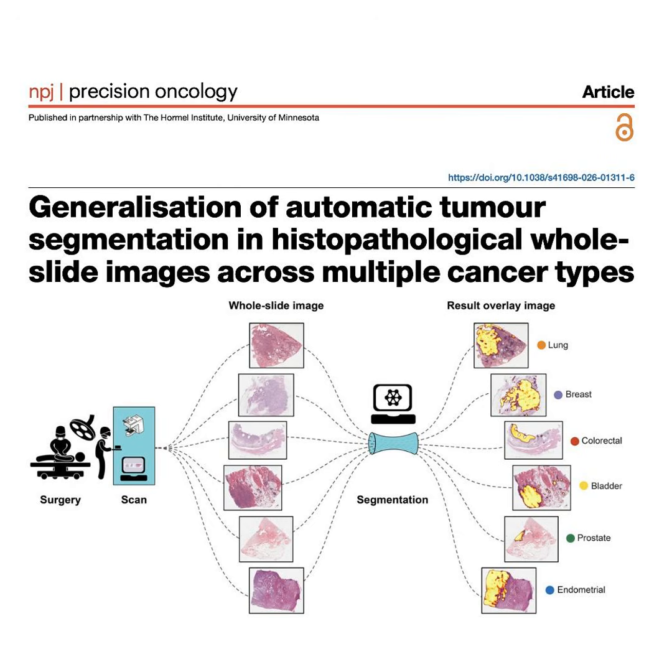Yeah, which brings up the classic machine learning trap: class imbalance. Right. If you feed an AI 10 times as much lung tissue as endometrial tissue, it's naturally going to optimize for the lung tissue just to get the highest overall score. Exactly. It becomes completely biased toward the majority class. It gets lazy, basically. So how did they fix that? To prevent that bias, the researchers actively oversampled the minority groups on a tissue section level. Meaning they forced a perfect balance? Yes. They forced a perfect balance in the data set, so there were exactly 3,519 tissue sections per cancer type fed into the model. Oh, wow.